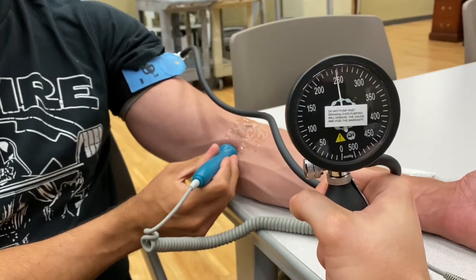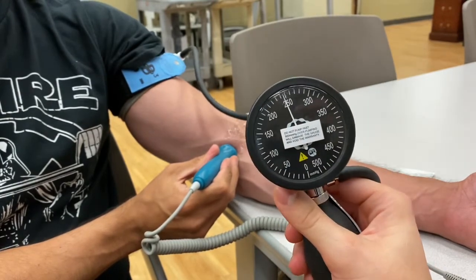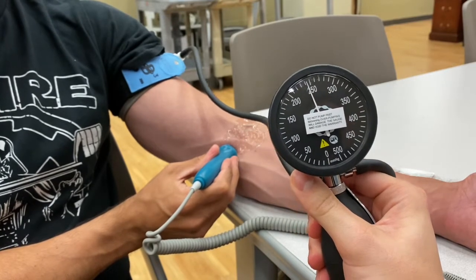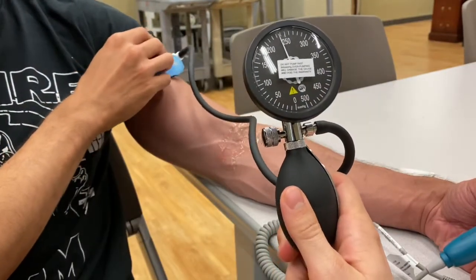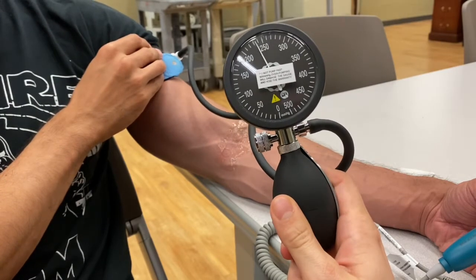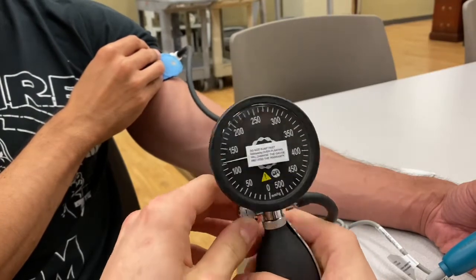All right, and all the blood flow is cut off at what point? At around 250 millimeters of mercury. So what you would want to do is base your percentages off of that number. Okay? All right, and always remember, if you're working with, let's say that this was actually dialed down to 40% of that number, let's actually go down to around 115, because that's going to be around 50%. I said 15%, I meant 50%.